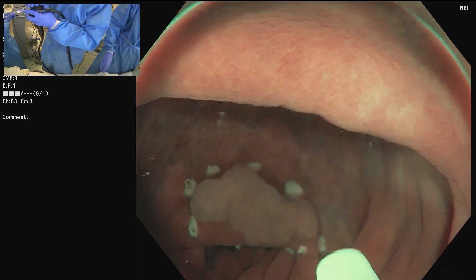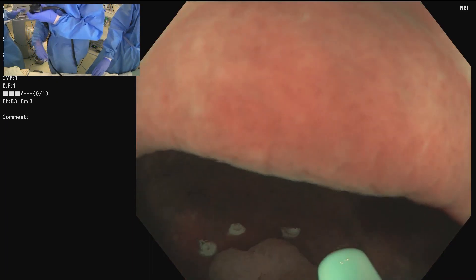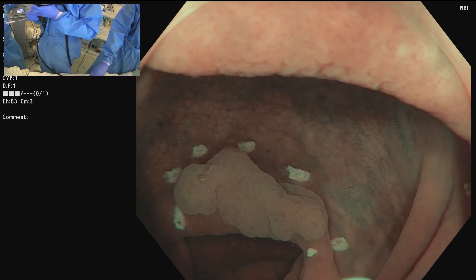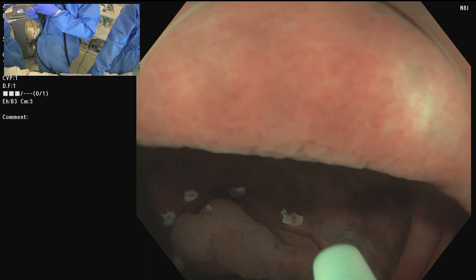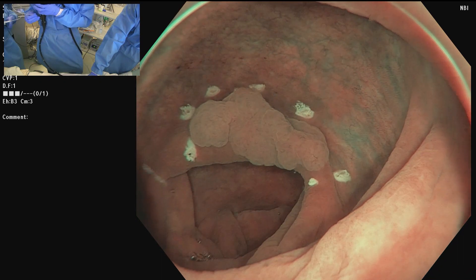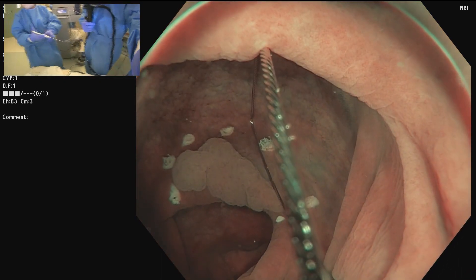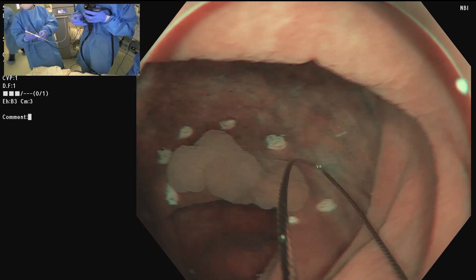Look how it's all nicely contracted. That contractility facilitates the technique. Open the snare — this is a big snare. Why use a 33 mm snare if the lesion is 15 mm?